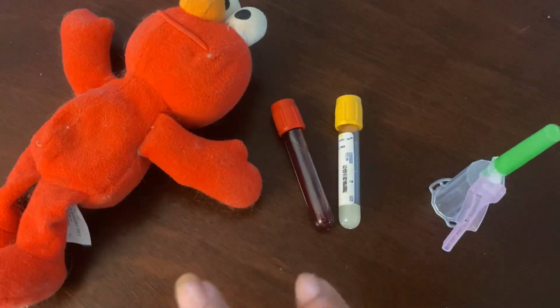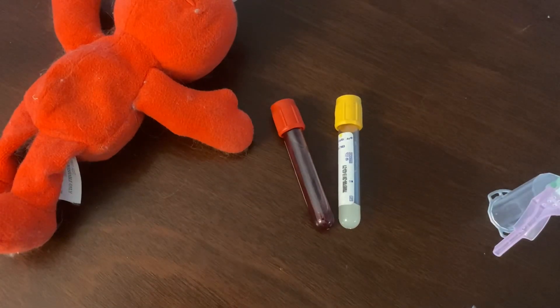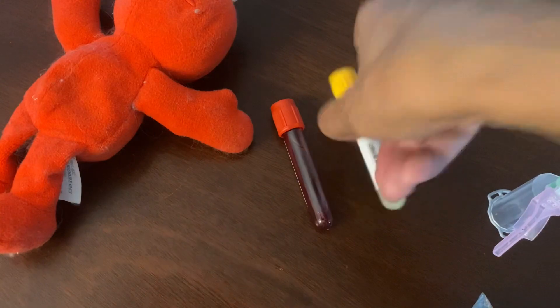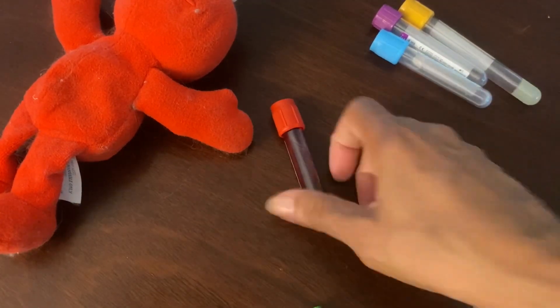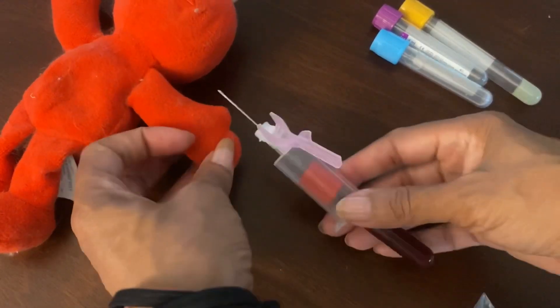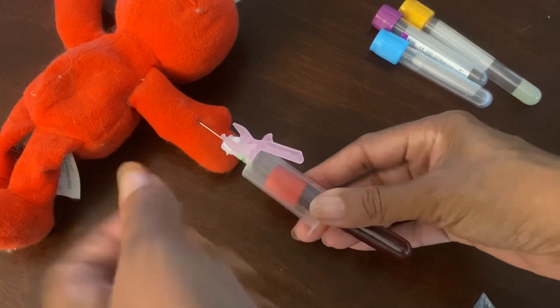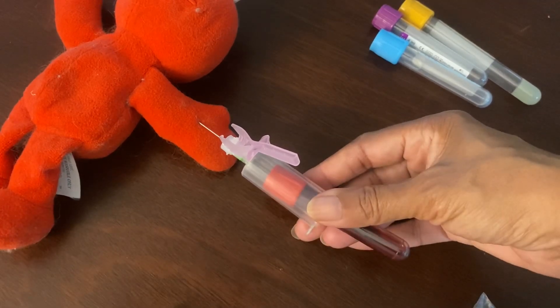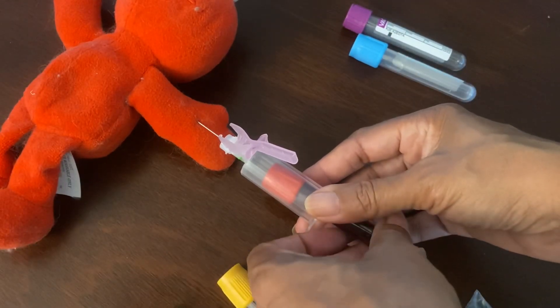This is a two-for-one. The other thing I wanted to show and mention is switching hands again. This is a right-handed person setup, and just for sake of supposing, let's suppose we needed all of these tubes. We've already gotten our first tube — as you can see, we have blood in it. And we stuck with our right hand.